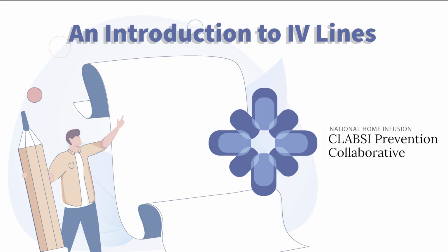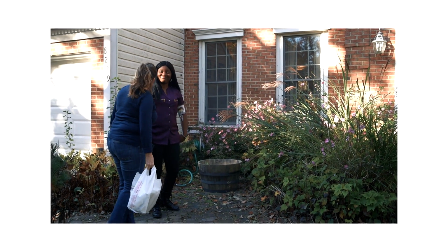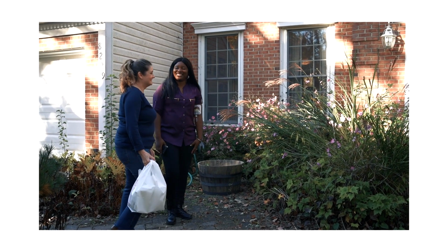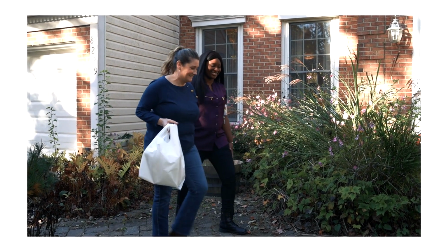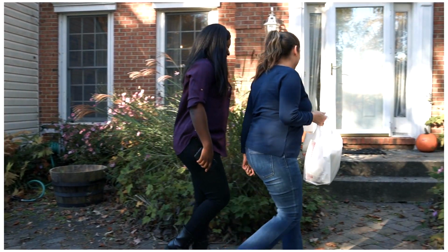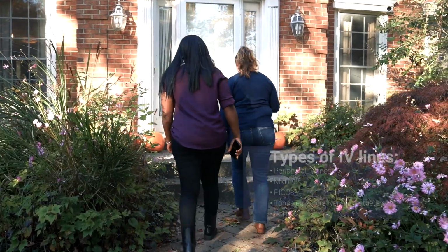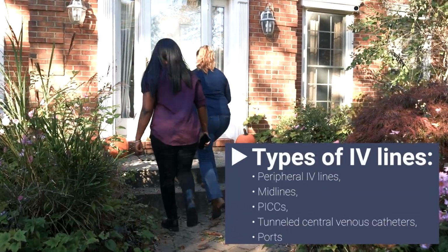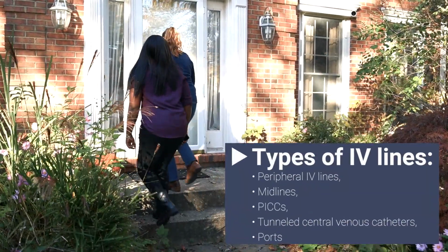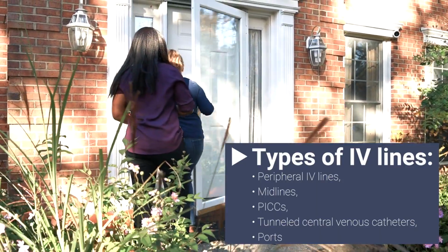This video focuses on types of intravenous or IV lines you might have in the home. Intravenous lines allow medications, fluids, and nutrition to be delivered directly into a vein without needing a new needle stick each time. They start outside the skin and end inside a vein. Types of IV lines used in the home include peripheral IV lines, midlines, PICCs, tunneled central venous catheters, and ports.